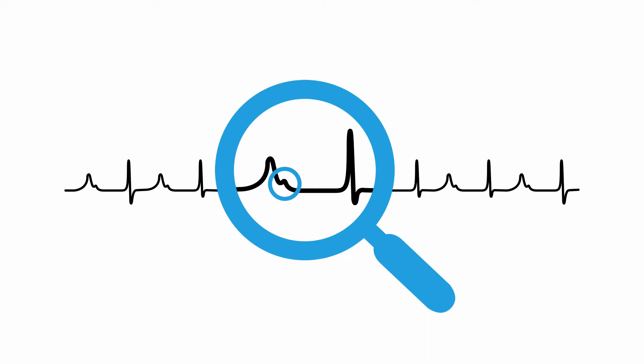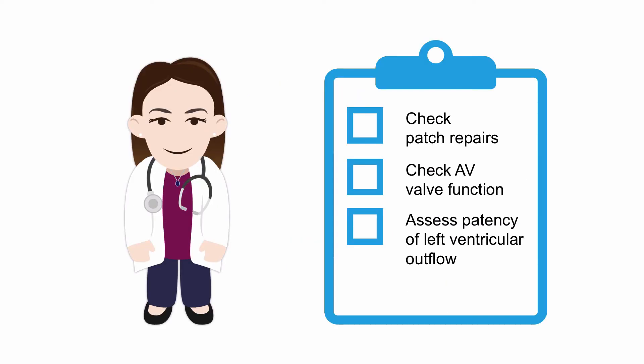AV block is common in these patients, so keep an eye out for that too. All that surgical origami involved in a complete atrioventricular septal defect repair means the potential for unusual residual jets is high, but with echo superpowers we can establish if these are concerning or not. It is important to check the area of patch repairs at the atrial septum and ventricular septum, check the function of the atrioventricular valves, and finally assess the elongated left ventricular outflow tract — it should remain widely patent.